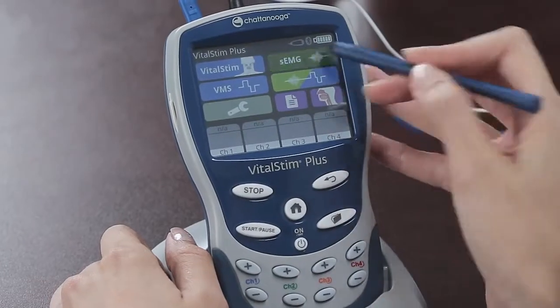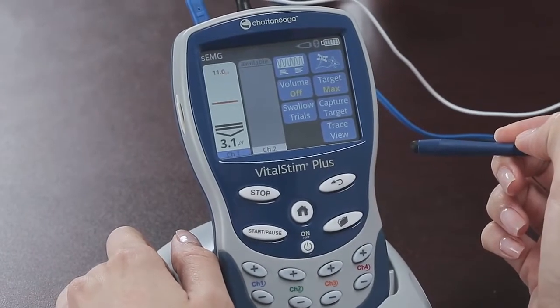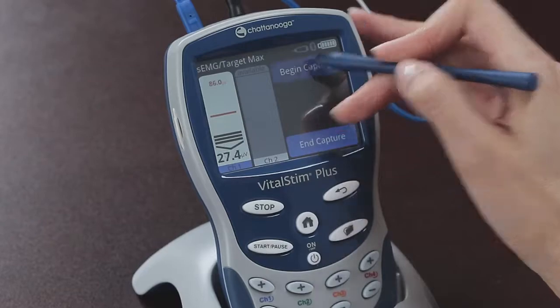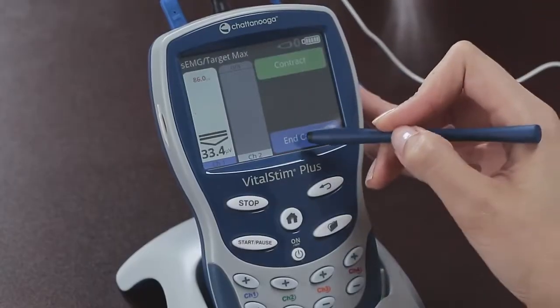Let's do this. Make sure the recording electrodes are connected to channel 1 and that channel 1 is highlighted on the screen. Also make sure that the reference electrode is connected somewhere nearby on the body. Now press Begin Capture and ask the patient to perform a couple of contractions. Press End Capture when you are satisfied with the effort.